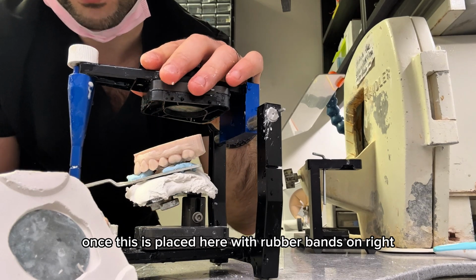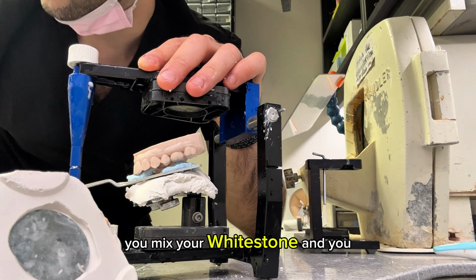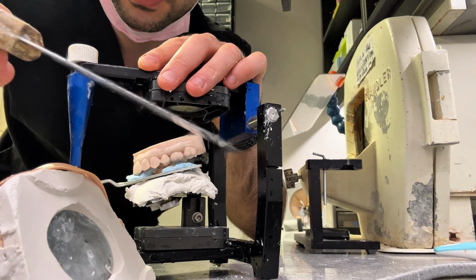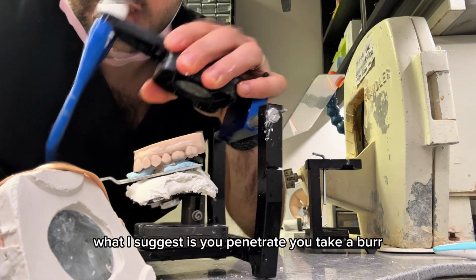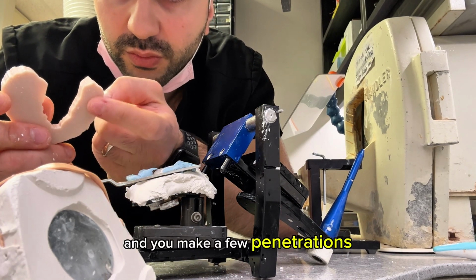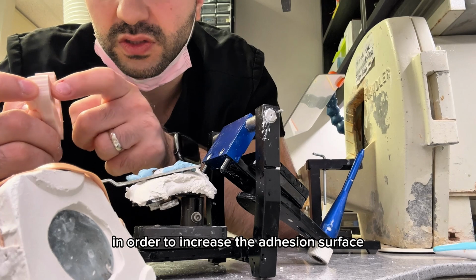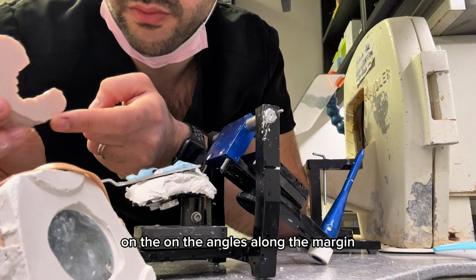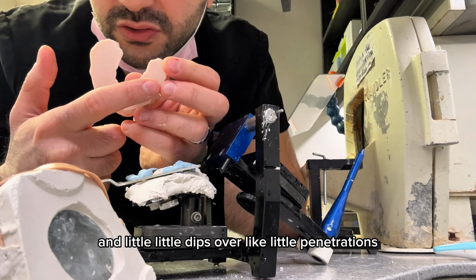Once this is placed here with rubber bands on to stabilize, you mix your white stone with cold water, mix it with a spatula, and you put it on the base here. What I suggest is you take a burr, whether it is a lab burr or a diamond, and you make a few penetrations. Do not hurt the teeth, do not touch the teeth, in order to increase the adhesion surface. So you do little cuts everywhere on the angles along the margin, and little dips over there, like little penetrations.